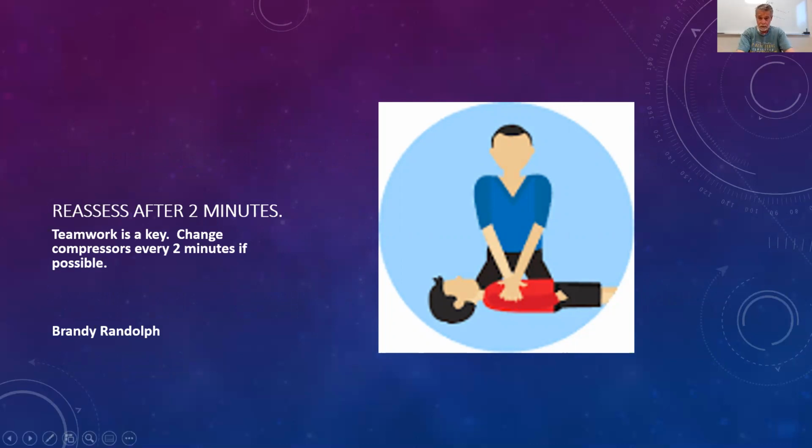Teamwork is key to this. And after about 2 minutes of CPR, almost anyone's going to be tired, if not exhausted. So always keep in mind, if there's an extra person with you, you want to change out that compressor every 2 minutes, if possible.